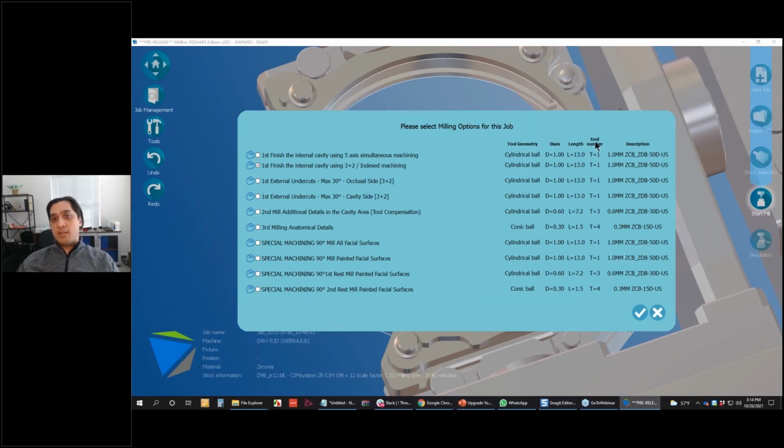And again, this is another reason why you want to keep your software up to date, or at least make sure that you always keep your maintenance active, so that as these features become available, as this one has, people that have the 2021 maintenance can actually download this, and if you want, you can start testing this as early as today.